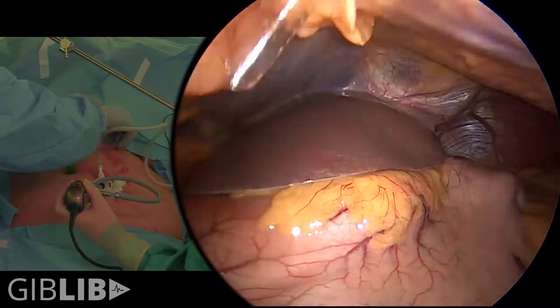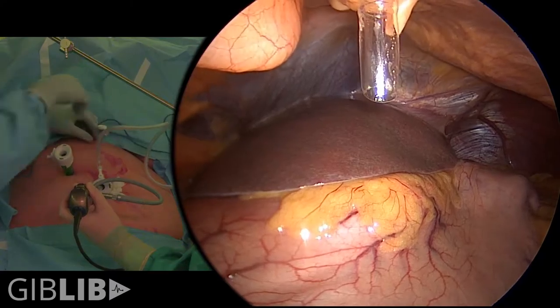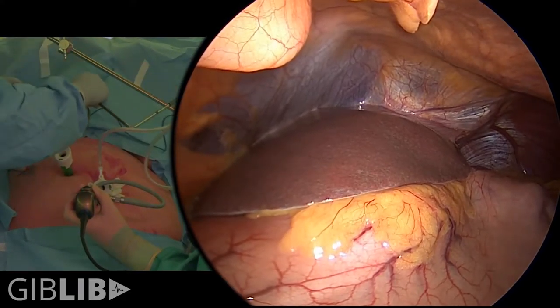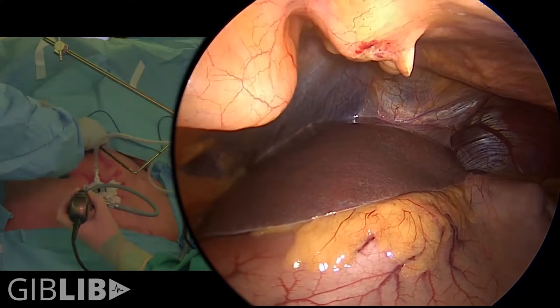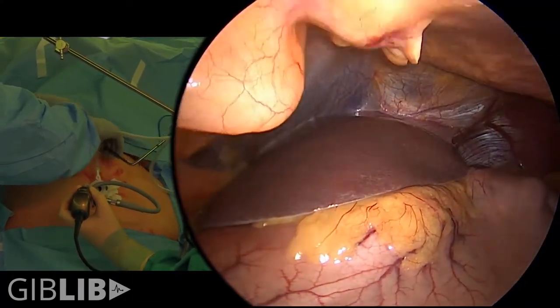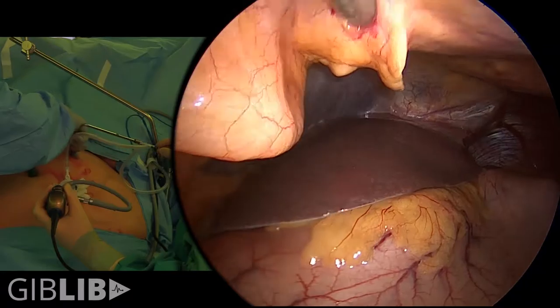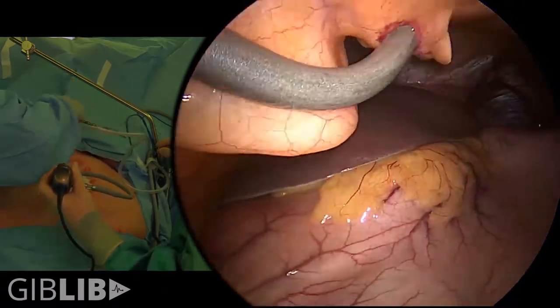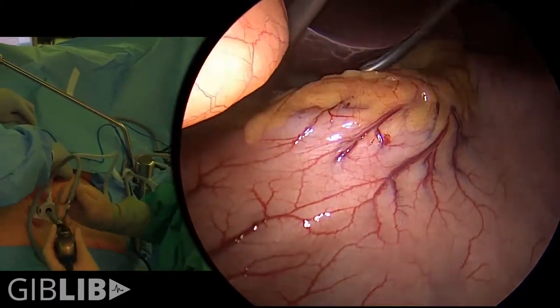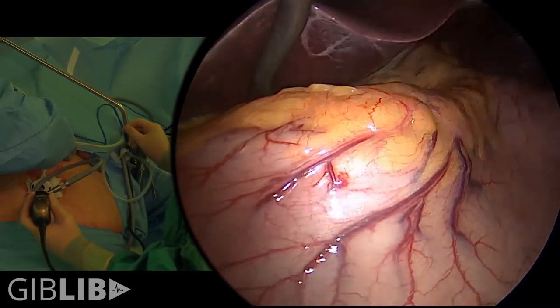This is the Takahashi maneuver, named for our first fellow Eileen Takahashi. It provides a little space so that we can get our Nathanson retractor in. The Nathanson retractor is shaped like a question mark, but it's atraumatic to the liver. The goal of placing this retractor is so that we can see the esophageal hiatus clearly and the angle of His.